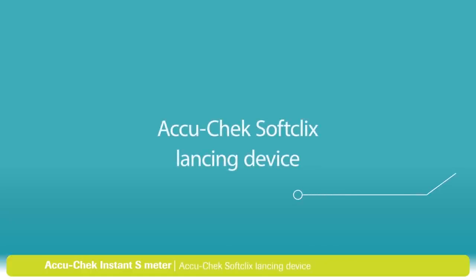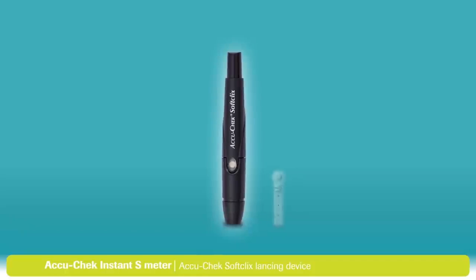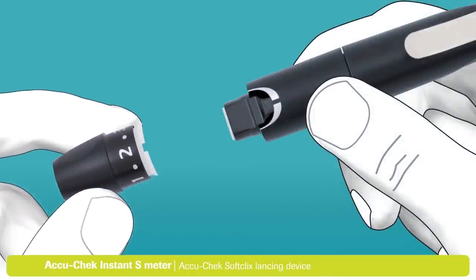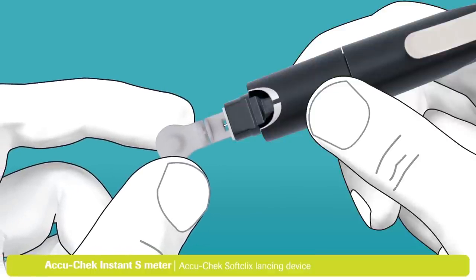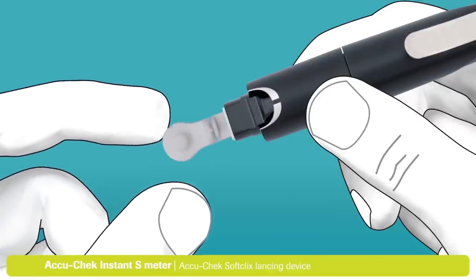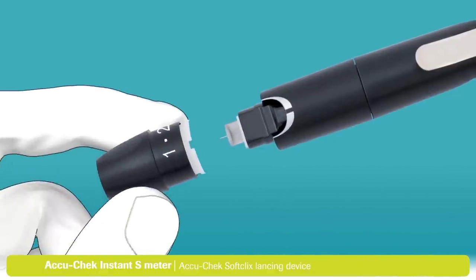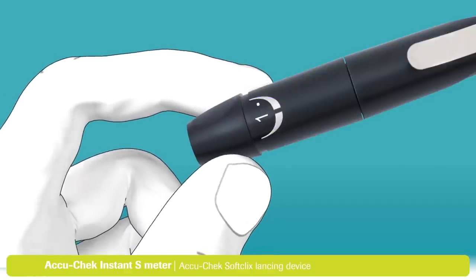Let's walk through setting up and using the AccuCheck SoftClicks lancing device. First, you will need to load your lancing device. For this, you will need an AccuCheck SoftClicks lancet. Remove the cap from the lancing device. Now insert the lancet into the lancet holder as shown. Push it all the way in until it clicks in place. Twist and remove the protective cap from the lancet to expose the needle. Place the cap back on your lancing device. Be sure to align the notch on the cap with the mark as shown.